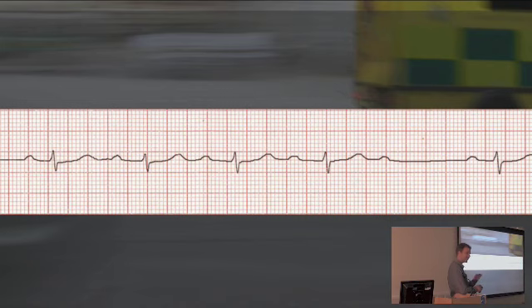Second degree heart block. Yeah, great. So it's a second degree heart block. The reason it's second degree heart block is we know we've got a prolonged PR interval. That would be first degree heart block. But it becomes second degree heart block because you're starting to miss some beats. When you're starting to miss beats, it's more than first degree, it's second degree heart block.